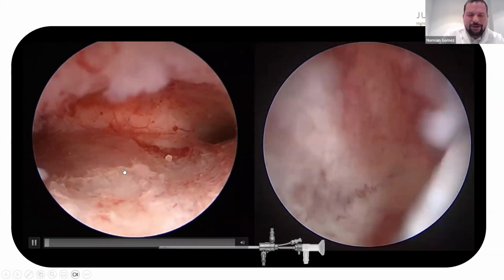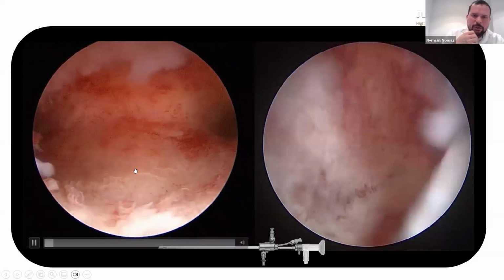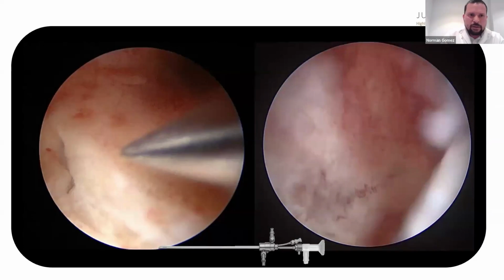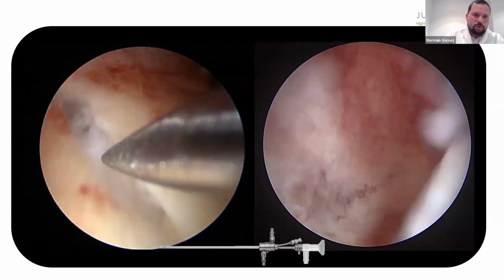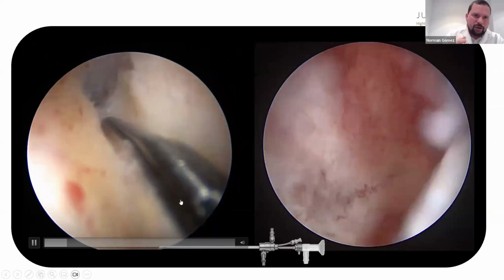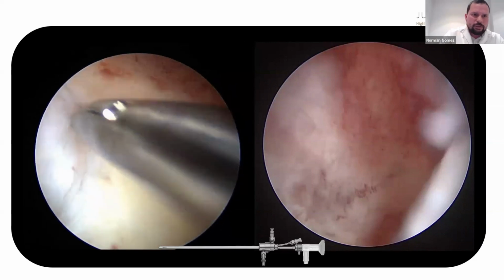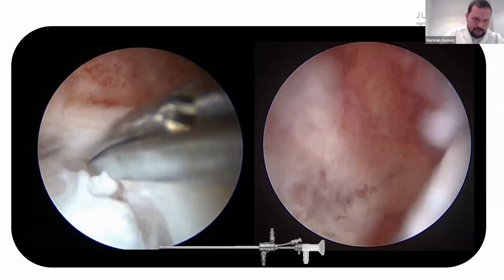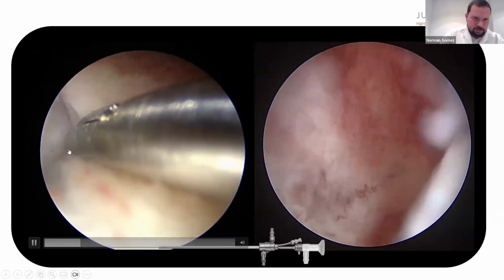You can see how you can reduce the pressure inside the uterine cavity and put in evidence the fibroid. But also, it's important to have the imaging techniques to complement the orientation inside the uterine cavity and to know where to find the fibroid. So we reduce the pressure, the myoma bulk inside the uterine cavity, and we know more or less the localization, and as in the previous case, we localize the limit of the pseudocapsule.